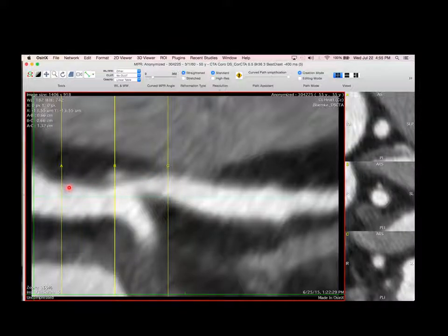You can look at where the calcium is and say, well, it should be a bump. Sure looks like a bump. But if you could actually image in and around this lesion to get the composite parts of that active coronary lesion, then you're in a better situation to know how old is it, what's the appropriate therapy at this point, should we go in there and put a stent, or should we leave it alone, etc.